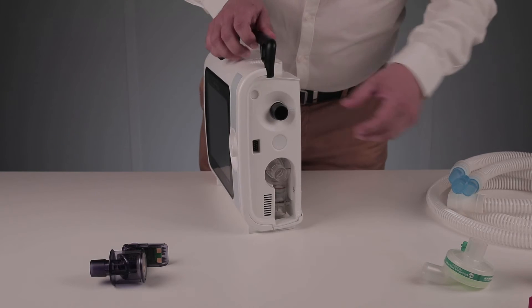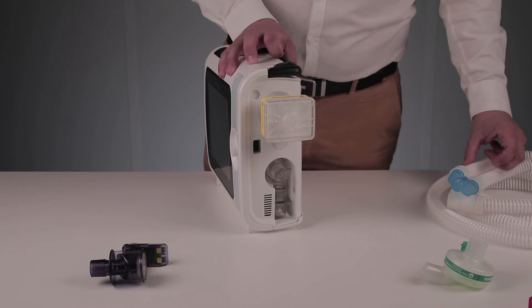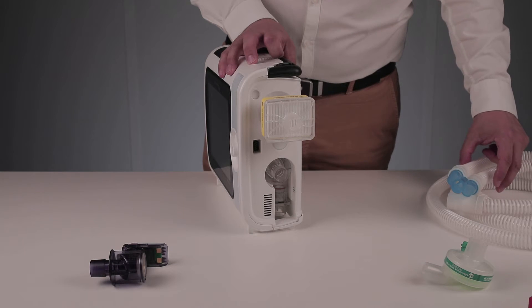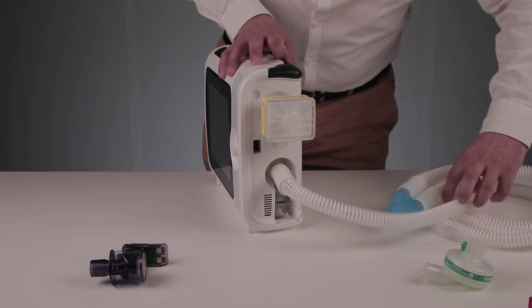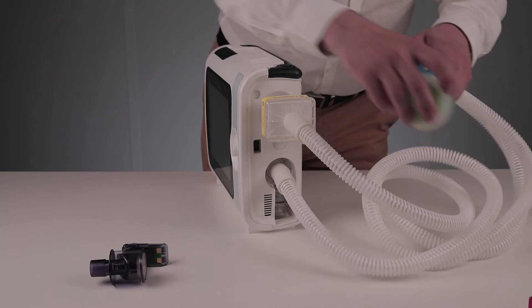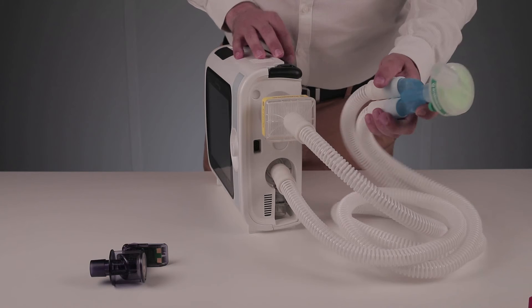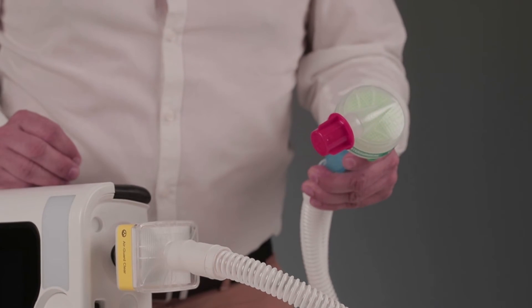Let's take the single use valve. Let's start by connecting a hydrophobic bacteriological filter to the inspiratory outlet of the ventilator in order to prevent any contamination of the pneumatic block. Let's connect a double circuit for an adult patient. An HME filter — heat and moisture exchanger — can be used in addition to the hydrophobic bacterial filter. It should be placed at the wye piece level. Finally, let's put a cap on the proximal part.